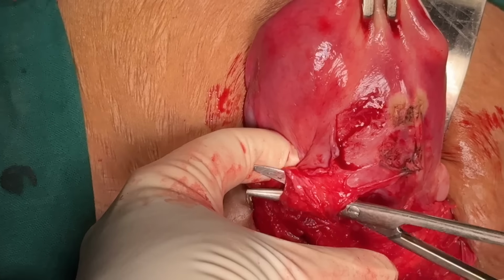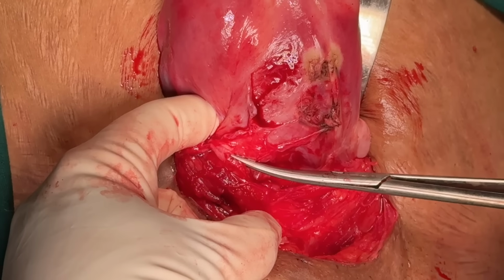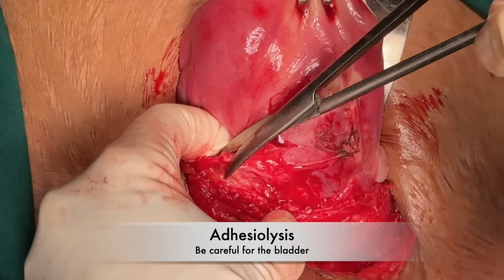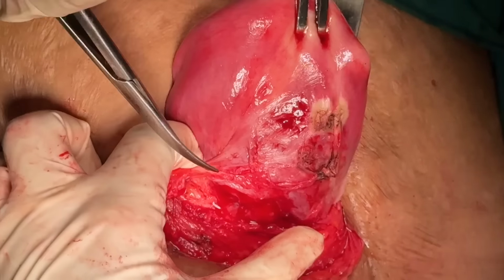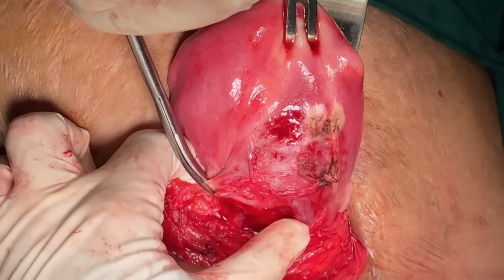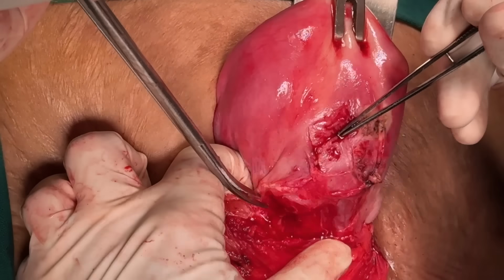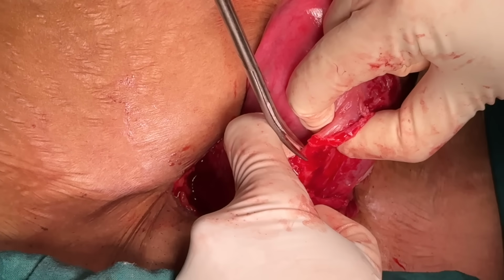Some previous two cesareans are so easy and smooth. However, some will have dense adhesions like this. So every case needs to be individualized. And remember, whenever you are releasing adhesions from the anterior surface, which are usually seen in cases of previous cesareans, you have to be extremely careful. You should try not to cut the bladder.